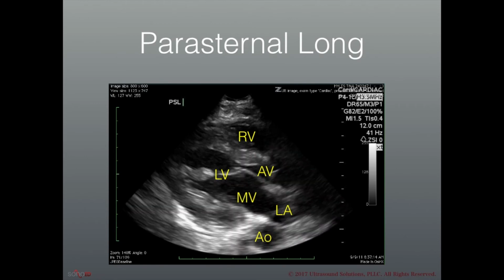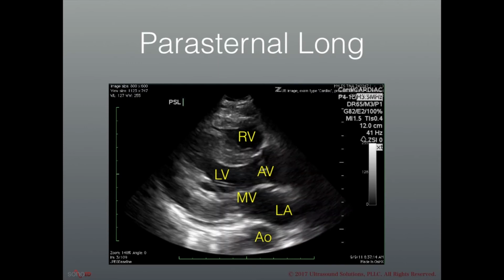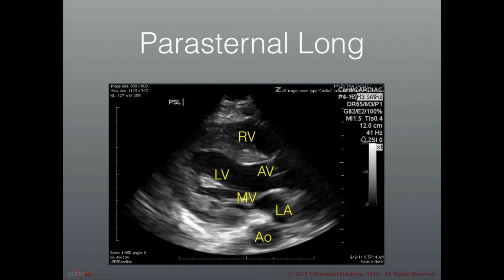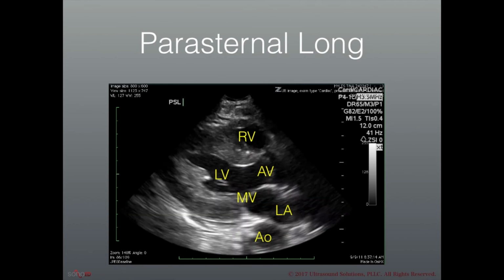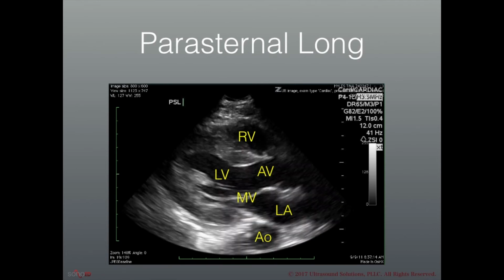The reason that's important is because pericardial fluid is in the pericardium, and so will traverse over the aorta and across the mediastinum, whereas a left pleural effusion will stay in the left chest and won't cross over the mediastinum or over the aorta.